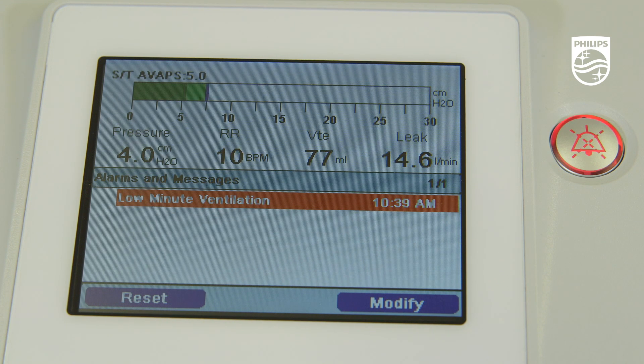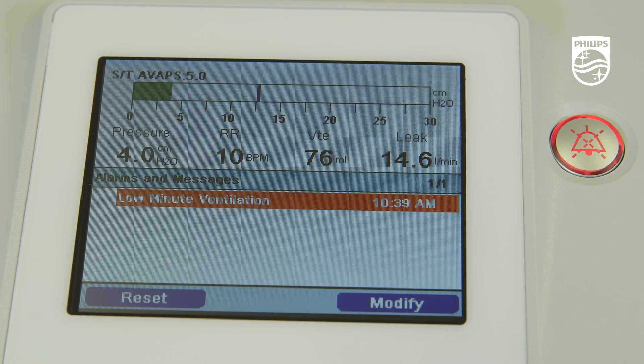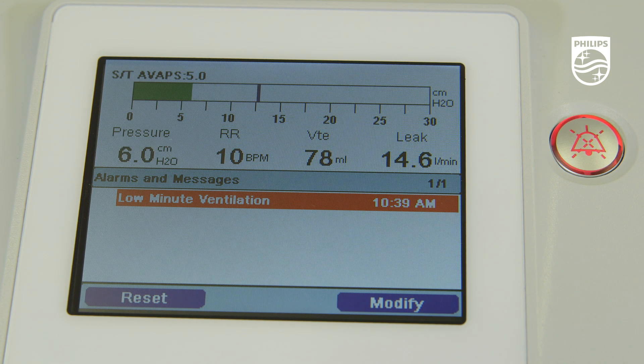You should note that there is also a pre-silence alarm feature. If an alarm occurs during that time, the audible indicator will not sound until the end of the silence period.